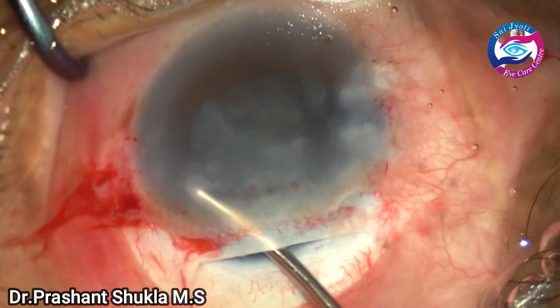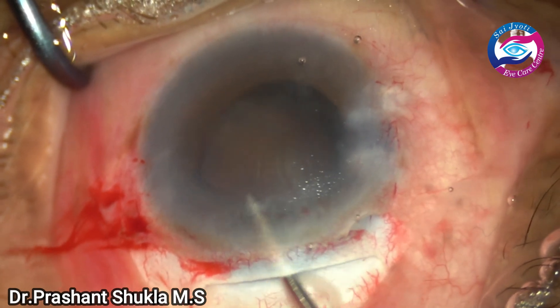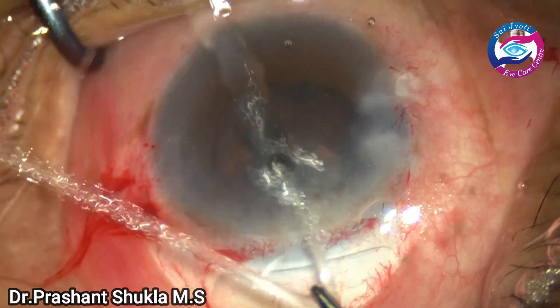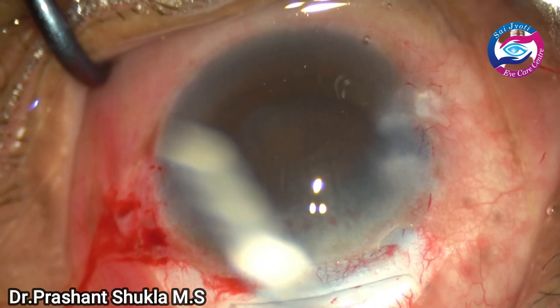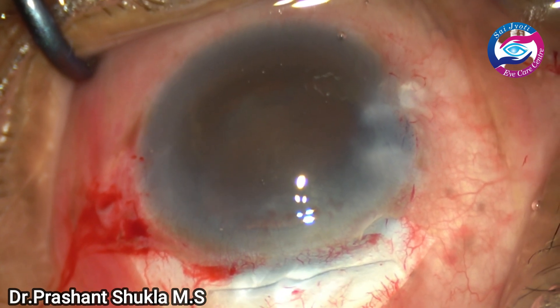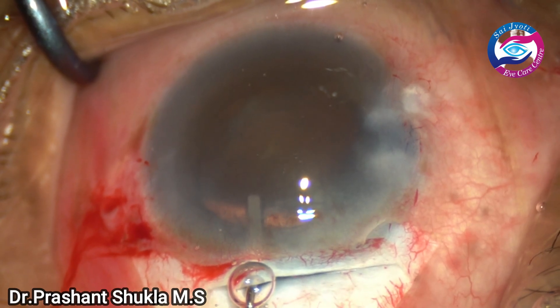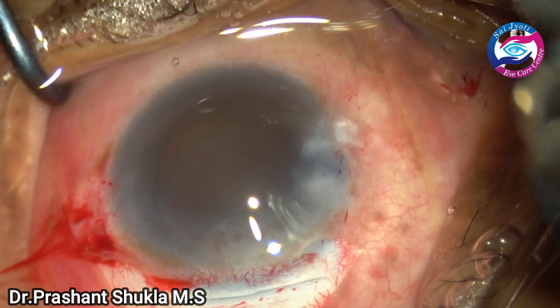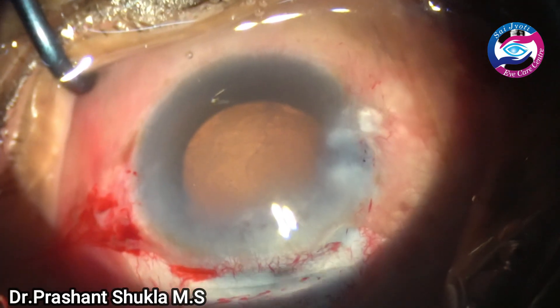The loose cortical matter as well as the epinucleus is just irrigated out from the eye using the irrigation handpiece of the bimanual irrigation-aspiration system. The pupil size has also become slightly smaller. There is not much cortical matter because the majority was aspirated out during the decompression of the capsular bag. Now it is time to implant the intraocular lens — the capsular bag is filled with cohesive viscoelastic.